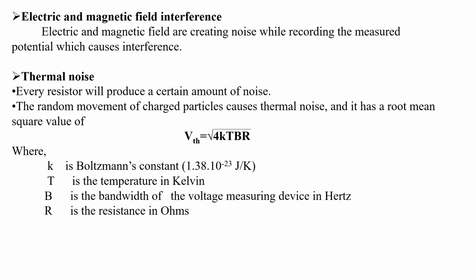Next we will see electric and magnetic field interference. While measuring the recorded potential, there is always EMF, electric and magnetic field interference, which creates a noise.